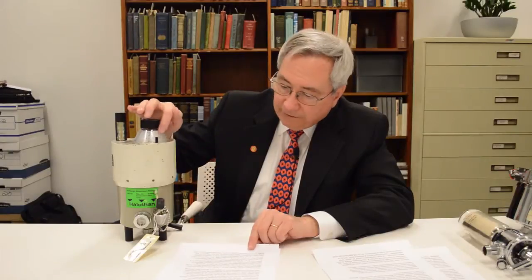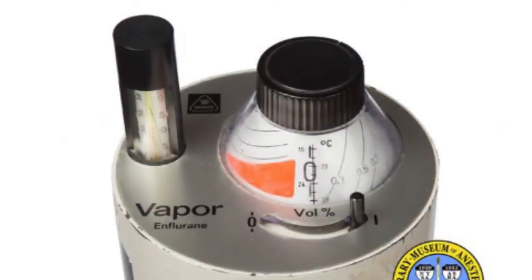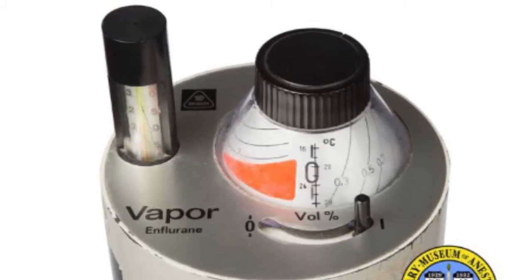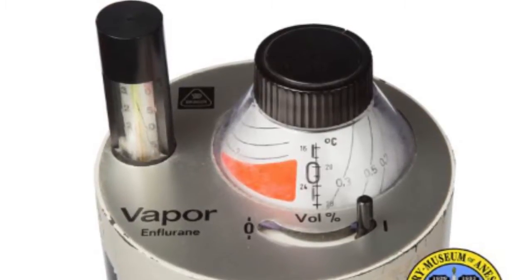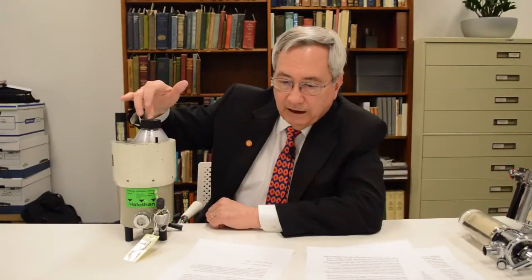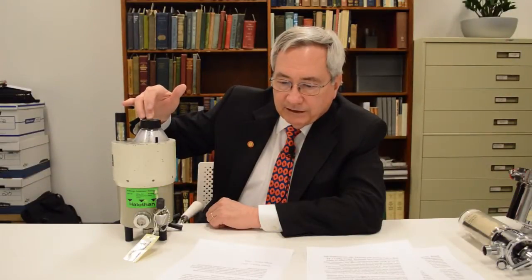Now, if you look at this dial, you'll notice that there's a series of temperature-specific slanted lines. And by looking at the measured temperature of the anesthetic agent and then picking the corresponding line, the concentration dial setting could be adjusted to provide for a highly predictable halothane concentration.